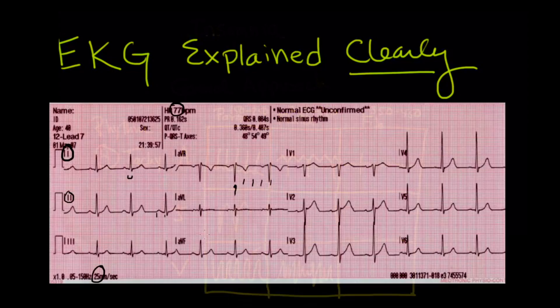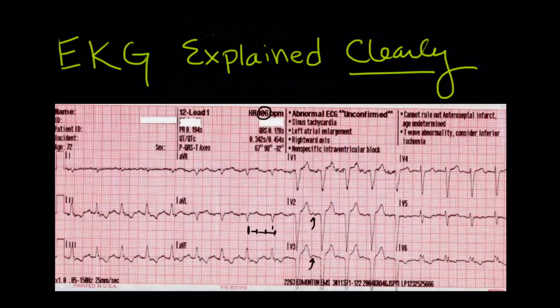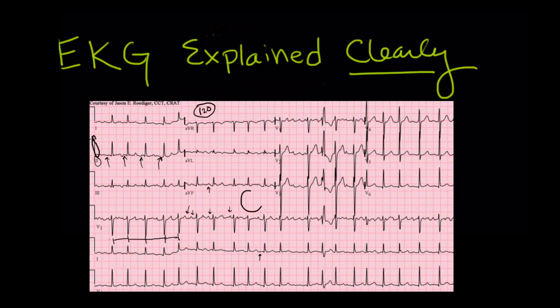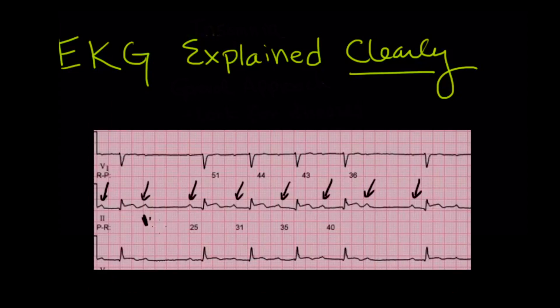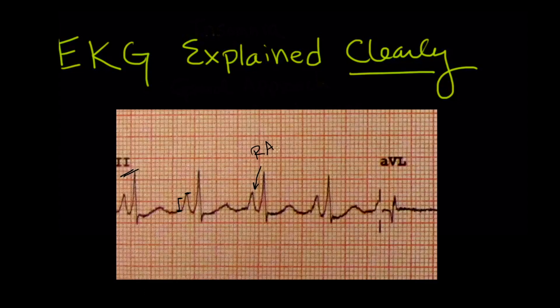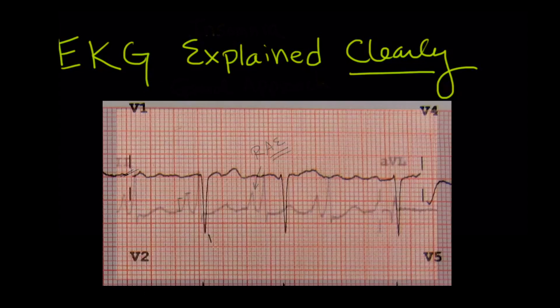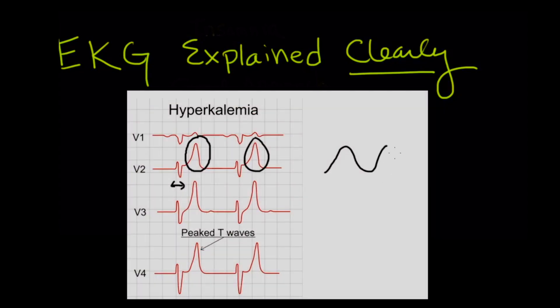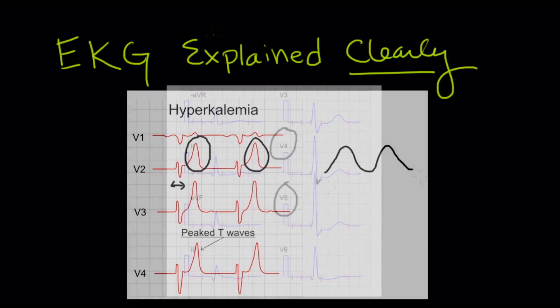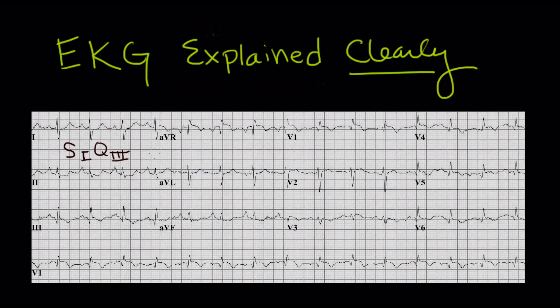We'll go through a normal EKG first and then on to a variety of abnormal EKGs like sinus tachycardia, atrial fibrillation, multifocal atrial tachycardia, first, second, and third degree heart blocks, atrial enlargement, ventricular hypertrophies, hyperkalemia, rare anomalies, and many many more abnormal EKGs.